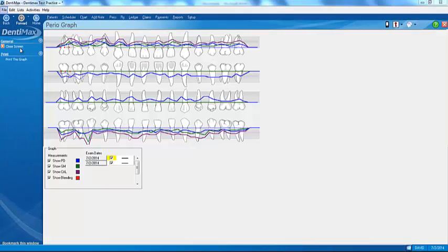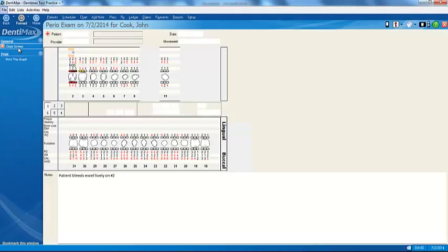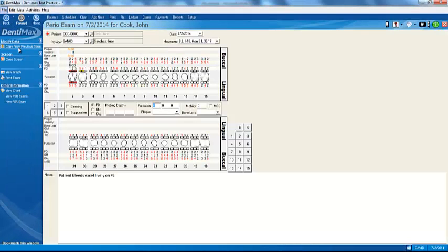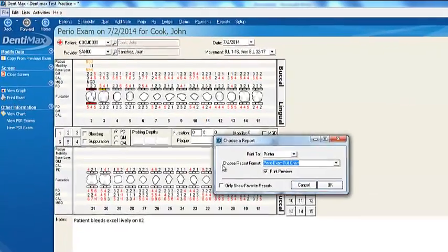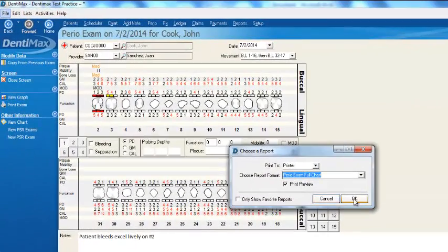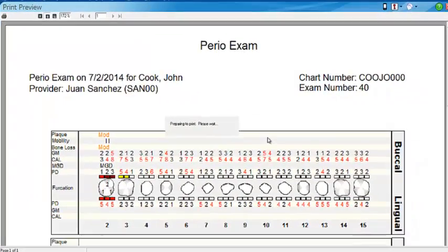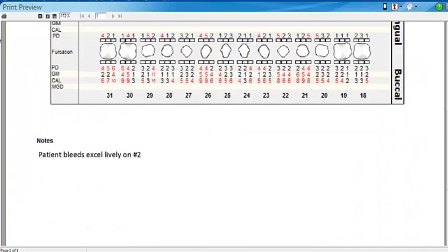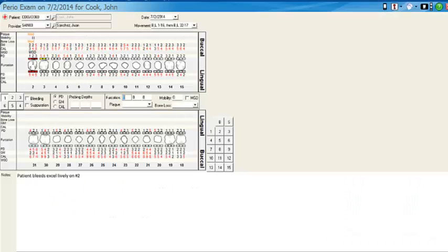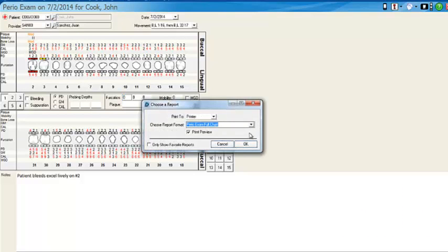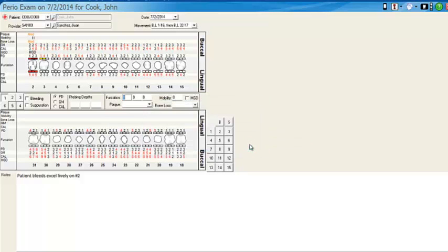I'll close the graph screen and go back to our perio exam screen. From here, we can print out our exam — just click on print exam. You can print with a full chart, or if you choose, you can print just the regular exam without the full chart.